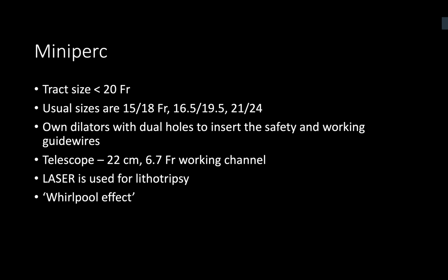It's a very clever system where at the tip it will create a whirlpool effect. It is designed for fluid to come in with high pressure, and then it expands like a fountain. So what happens is, after the lithotripsy, when you withdraw your scope, the stones easily wash out through the scope.